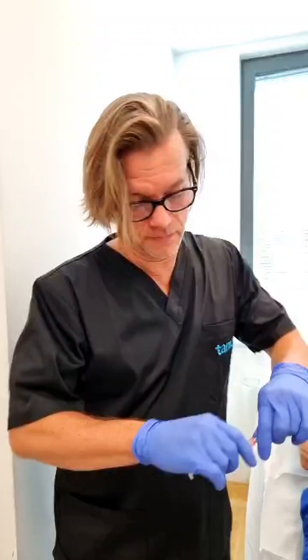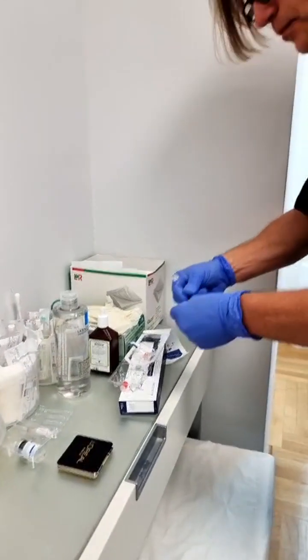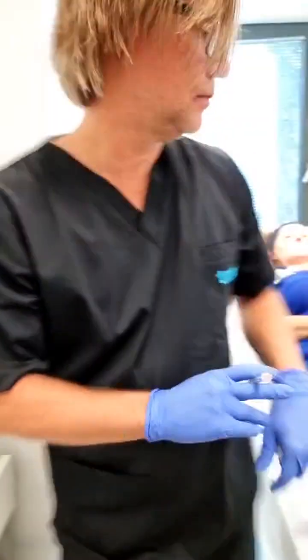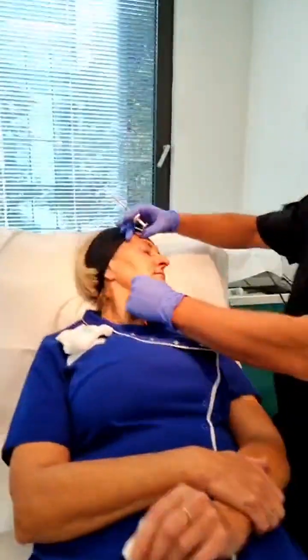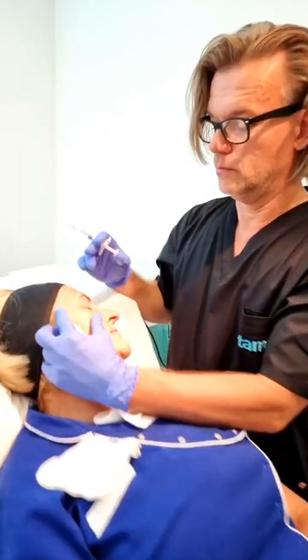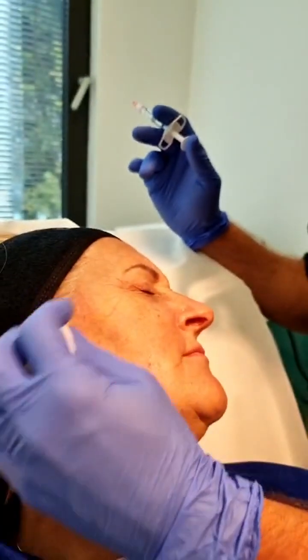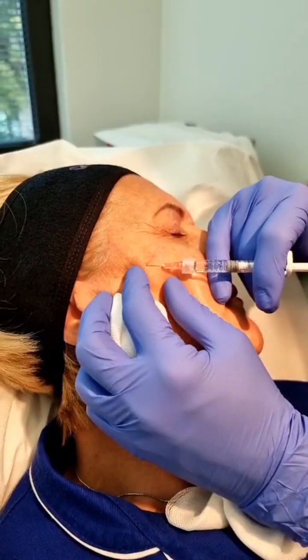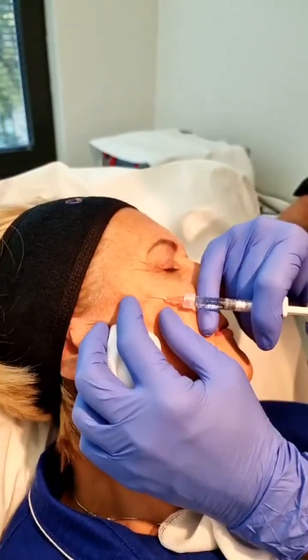Get this. Get you fix your new needle. Go on this side. Close. What's the scar here? I have here like a mold. Okay, they remove me. Okay. Well, let's fix that. Well, the light is better on this side.